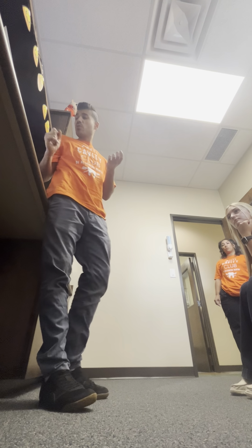Because for bilateral ones, you need to take an impression and we send it to the lab. I mean, you've seen the kids when we're taking impressions. It's not the easiest one. Now with the Splash, I don't know if you've been working with Splash lately, for me it's an easier thing. Still, some kids have a gag reflex and they can't really carry it down.